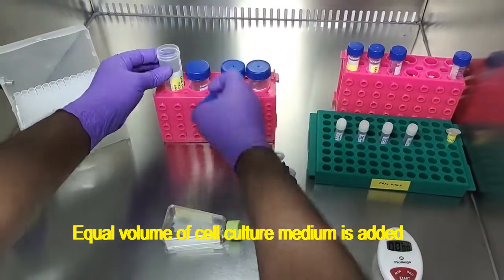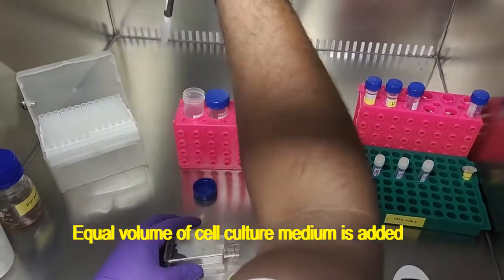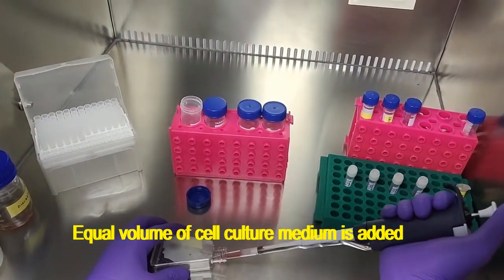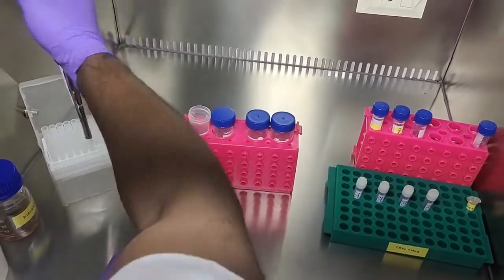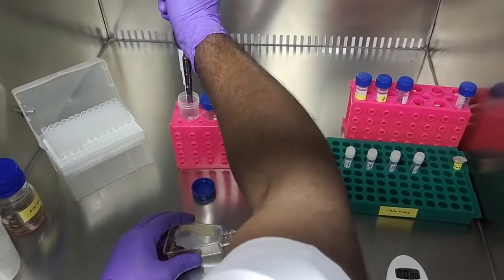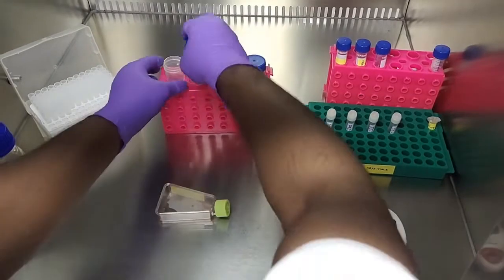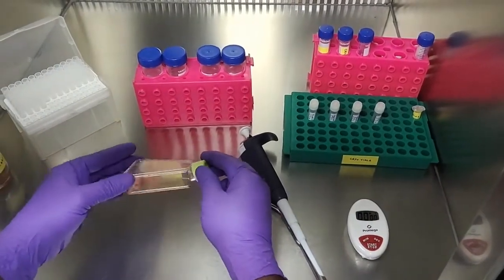Now an equal volume of cell culture medium needs to be added — the medium we are using is DMEM medium. Again, gently shake the culture flask.